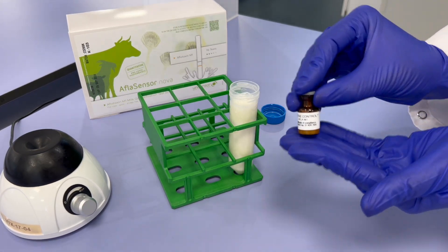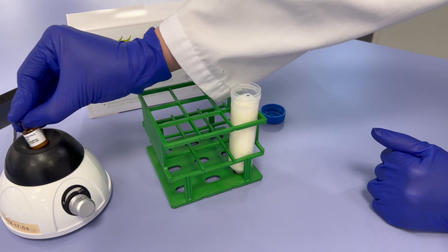Immediately vortex for 10 seconds. Take 200 microliters for testing with the kit.